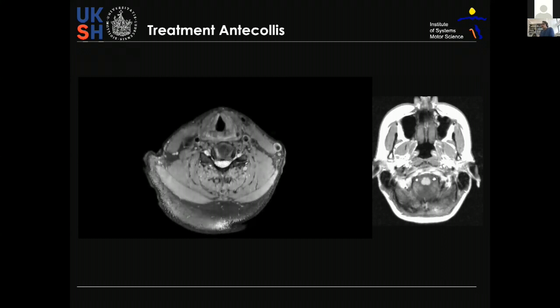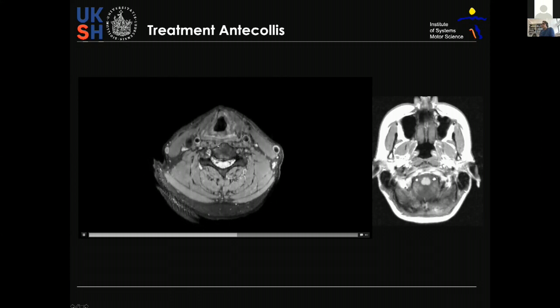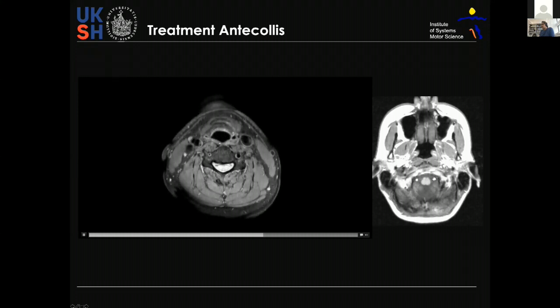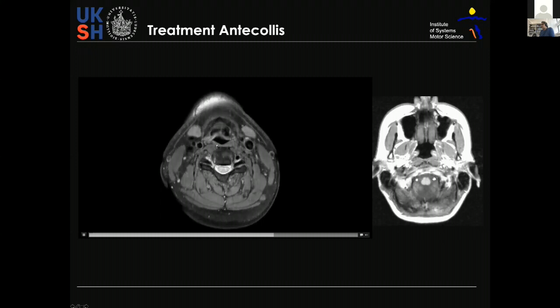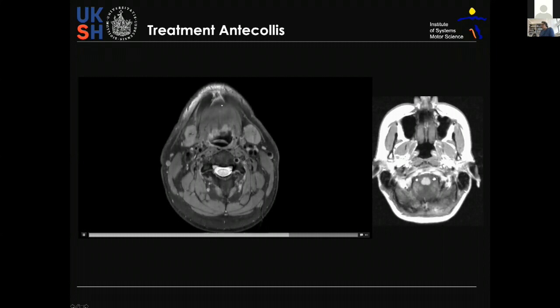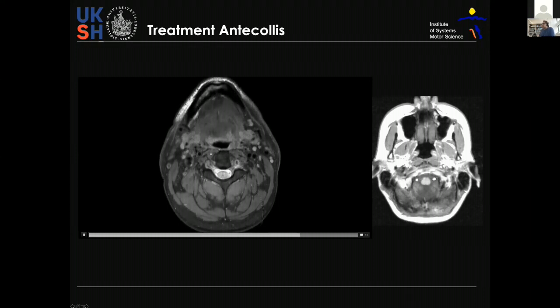So I thought about what this is about, and here you see an MRI, where is this muscle? The muscle is directly here in front of the vertebral bones and becoming bigger and bigger as you go up and up. And when you see the throat, there's a very, very tiny distance here. So we said, maybe we can do local anesthesia and go here above the tongue and inject here. And this is exactly what our ENT doctor did.